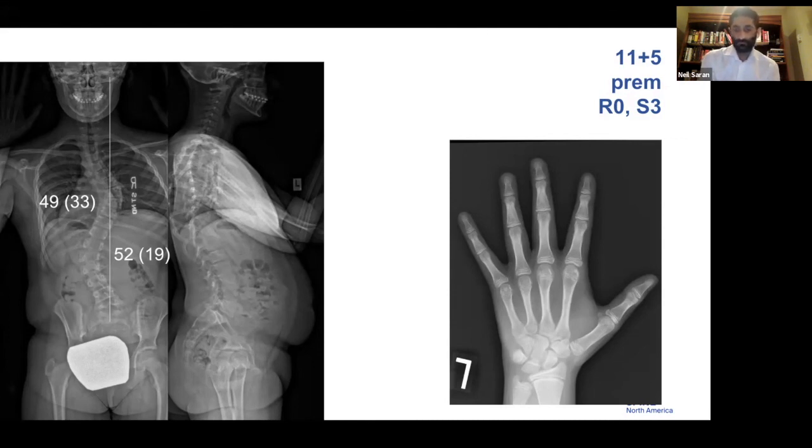Okay, great tip. For me, this is a patient where if we don't do anything, she's going to get a fusion T2 to L3 for sure. And this is really where I think if a tether works, it just makes the most sense. My concern always is, are both of them going to work? I'm already trying to hit a home run with one tether. Now I'm asking myself to hit 2 home runs with 2 tethers. So is this really feasible?